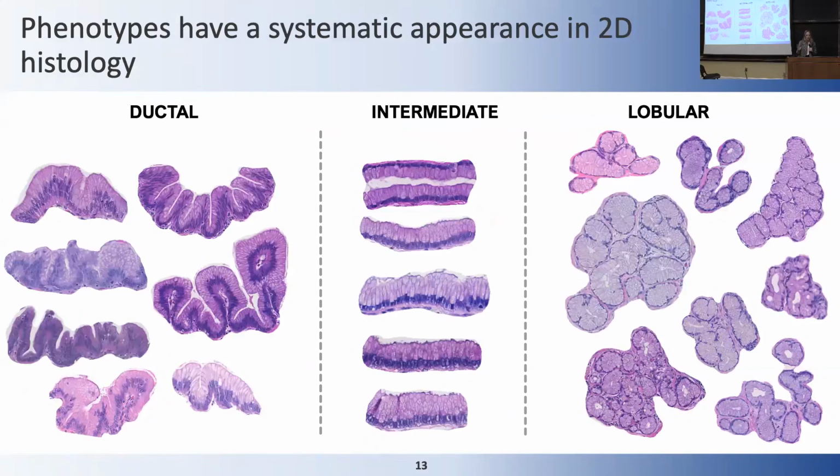So initially, she just collected some samples of what each of these look like, and you might be able to see immediately that we have distinct phenomena going on. All the way on the left, you see these wavy papillated epithelium with swollen nuclei and maybe even distinct cytoplasm. In the middle, you see a nice, neat line of cells. I like to think of them as almost well-behaved cuboidal nuclei. And then on this side, you see pale cytoplasm, and the nucleus is squeezed along the outside edge of the cell.